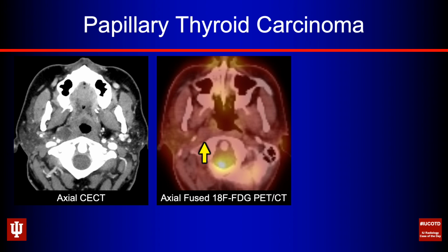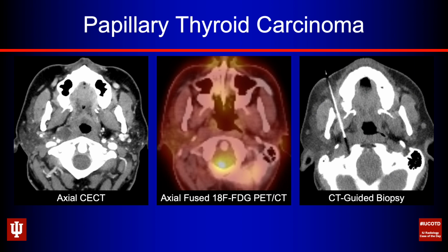And so how do you biopsy this? This is one that I did with a transfacial approach under CT guidance. It looks a little barbaric, but this is honestly a very safe approach, and it's tolerated well by the patients. So just find a safe window that you can put the needle in, obviously avoiding putting it through the carotid artery because that is certainly poor form. Whenever you biopsy these, you may not get a lot of cells, so make sure they're running a thyroglobulin washout on it, because if it contains thyroglobulin, you know you're dealing with a metastatic node.